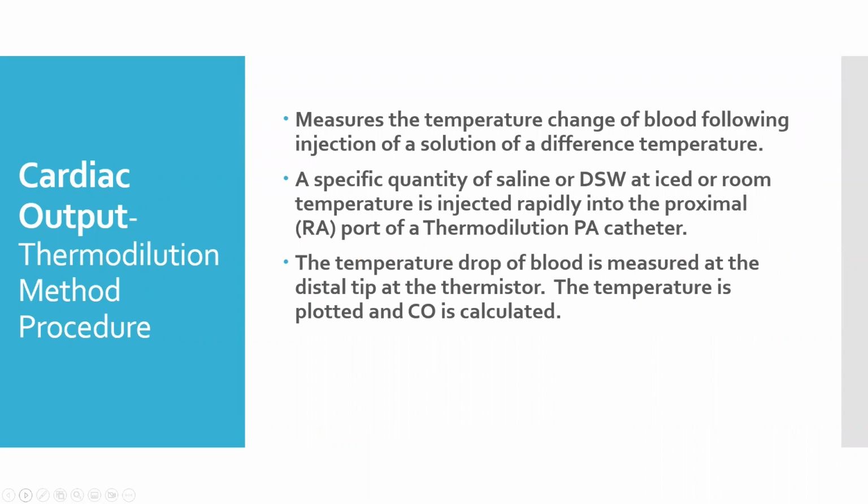Thermodilution, so it's not funny, but the interesting thing is that pulmonary artery catheter lines are called Swan-Ganz by some. It's not a central line, it's threaded further through the heart. And I'll show you that in a few slides, all right? The Swan-Ganz catheters are not used as widely as they once were.